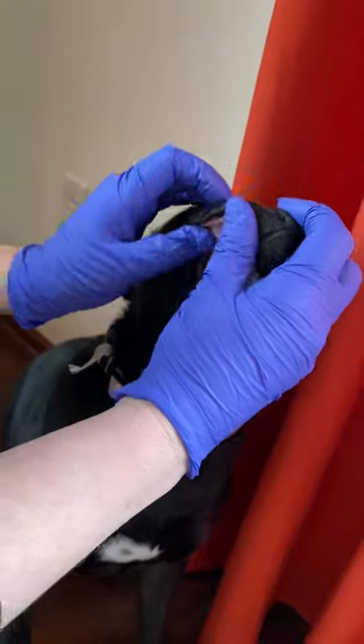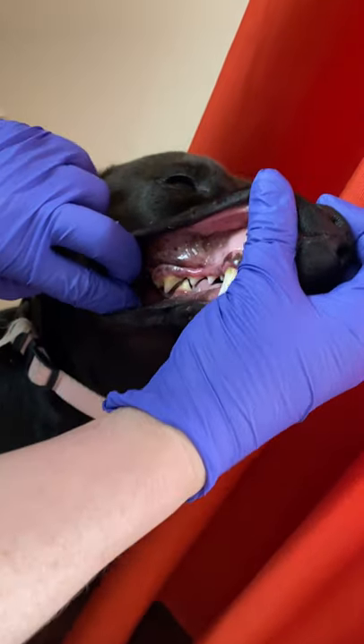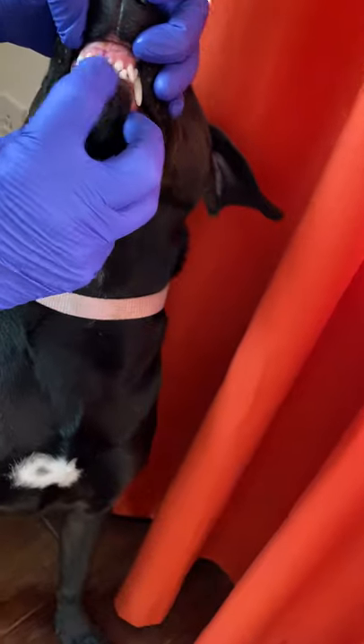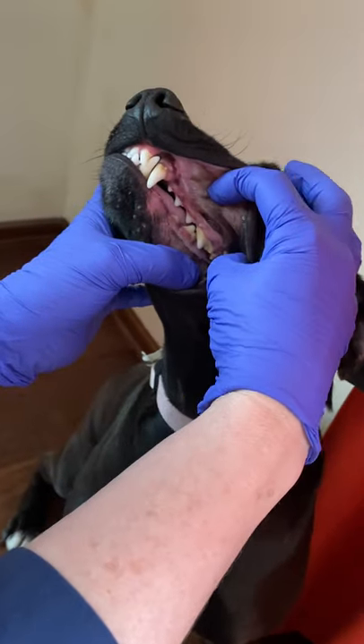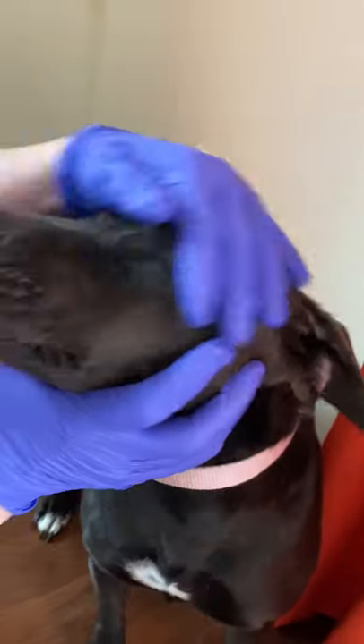Then I lift the lip — the lips are very stretchy — and stretch them so I can get a good look at her gums and her teeth. I do the same thing up front and on the other side, lifting those lips to make sure there's nothing abnormal on the gums, no growths, no ulcers, no sores.